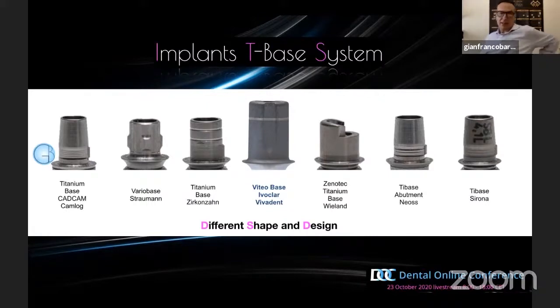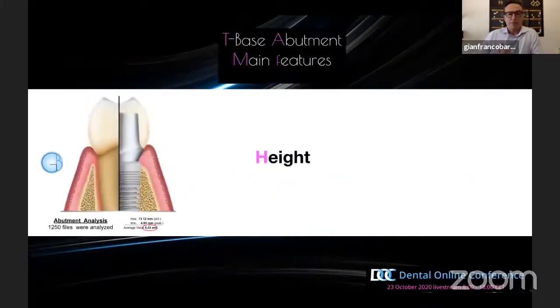Let's have a look at some features that these T-bases must have to be considered resistant. The first of all is the height.